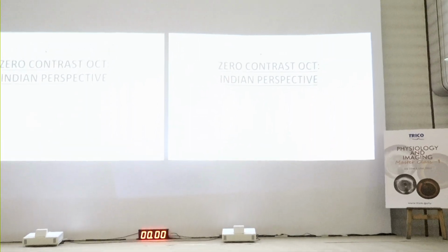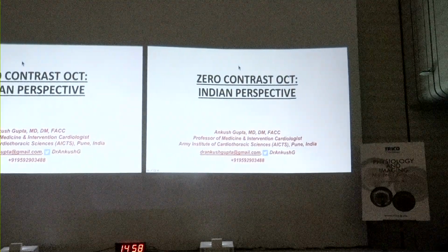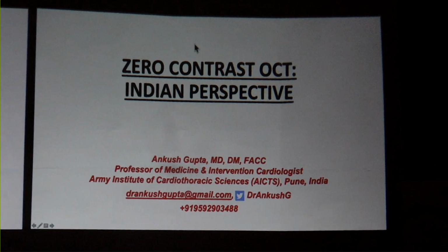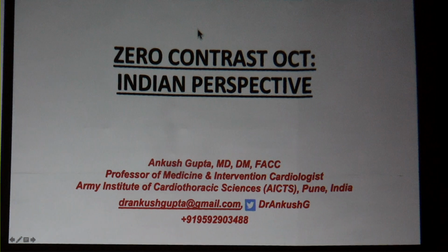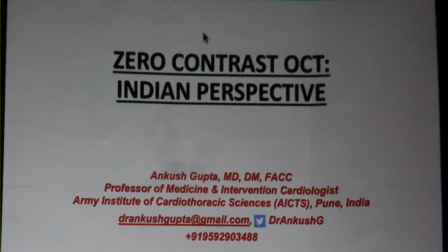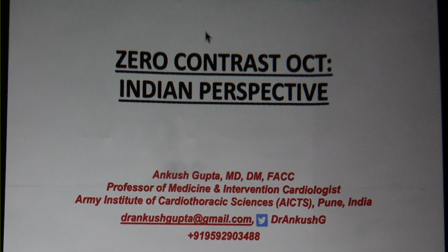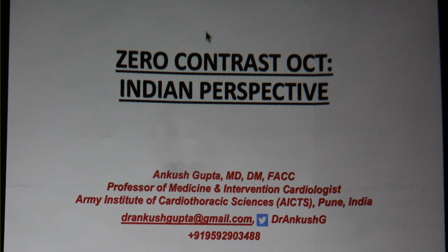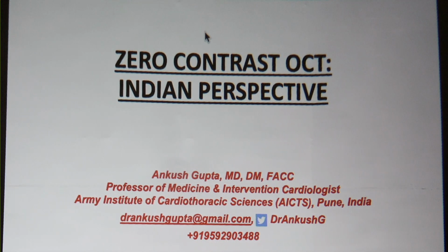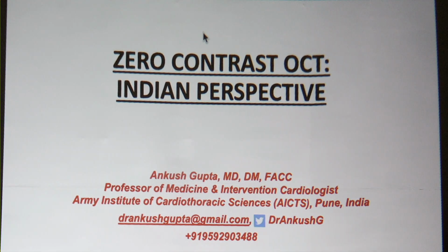As Dr. Sahoo said, people are very happy seeing OCT. Yes, it's very clear. You can see the coronary artery very well. But I strongly believe that in the present era, in selected cases, imaging should be used, either OCT or IVUS, because we have evidence that it improves the outcome. One of the major limitations when we think about OCT is the amount of extra contrast that may be required for flushing the artery to get images. So I'll be sharing with you our study on how to go about zero contrast OCT.